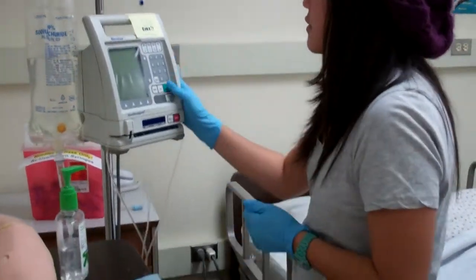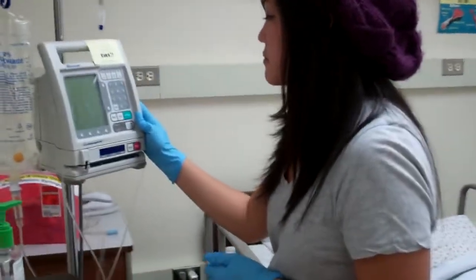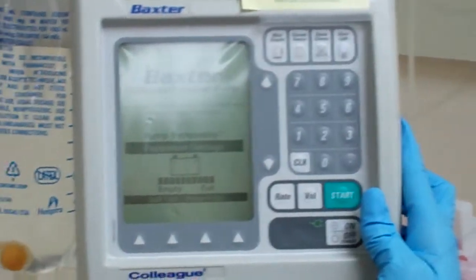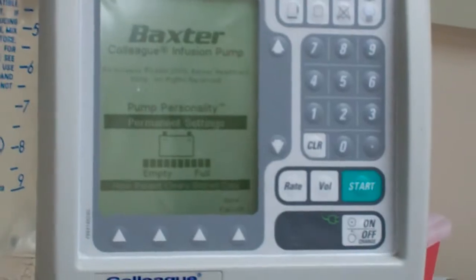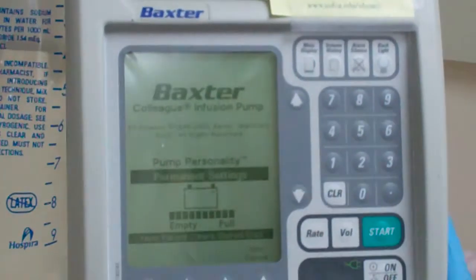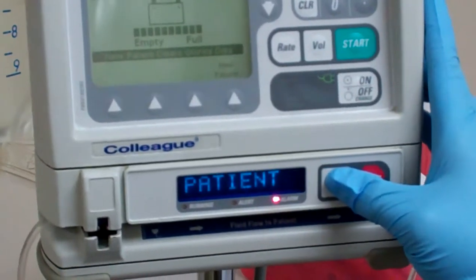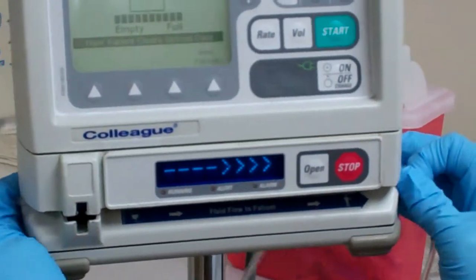And then I would just turn on my machine and hook it up.